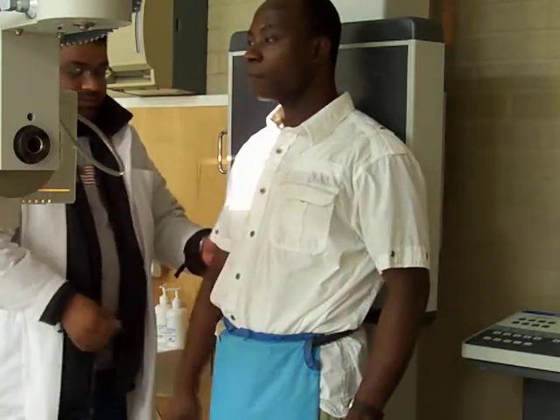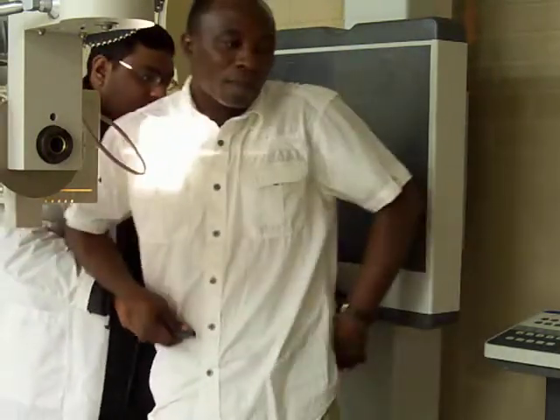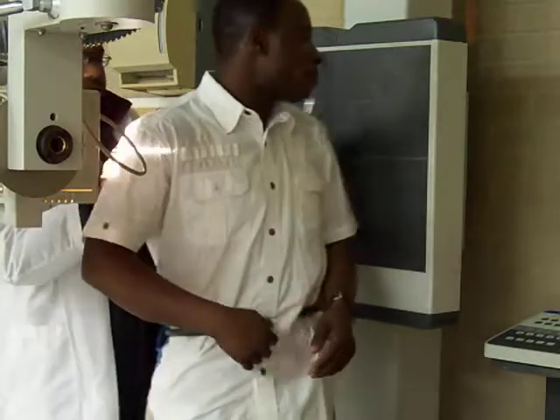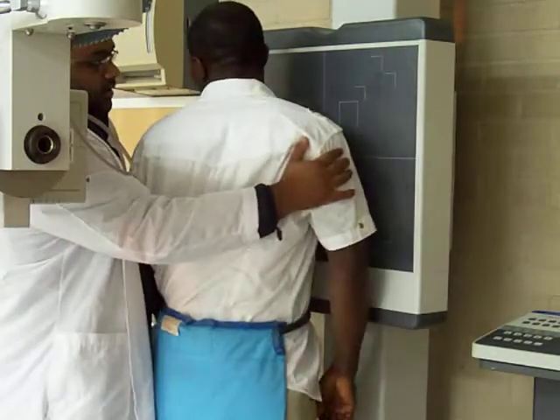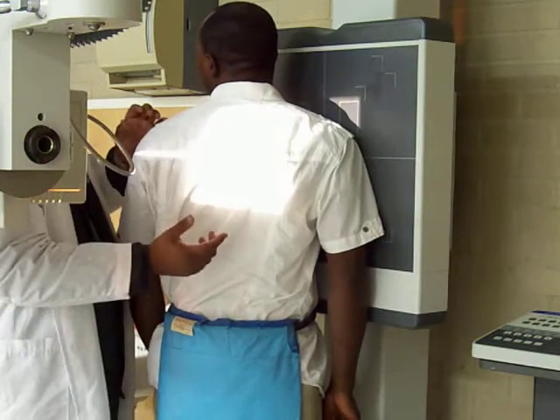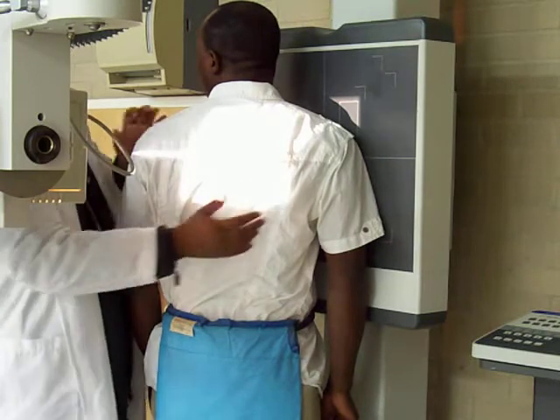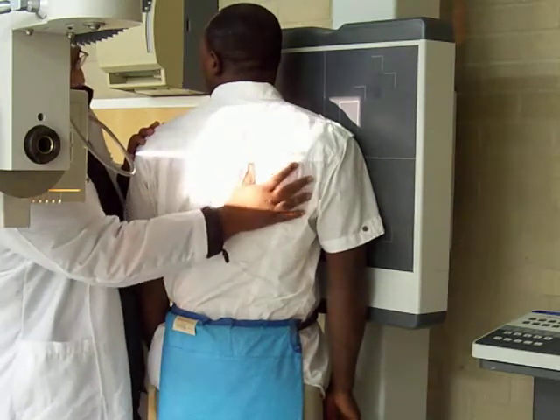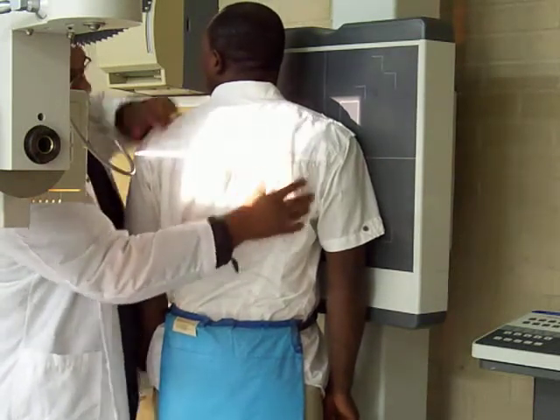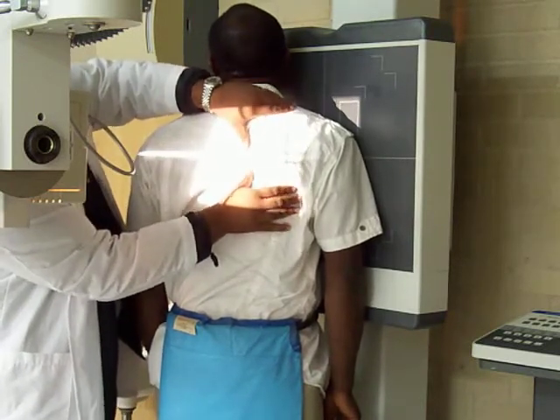We're doing the Y view. The thing with the Y view is that the patient should be at an angle of 45 degrees, and we should be centering the central ray at the midpoint of the scapula — so this is the scapula over here.